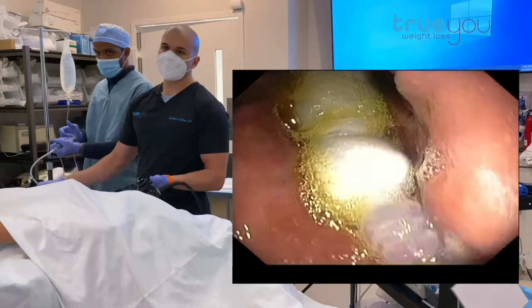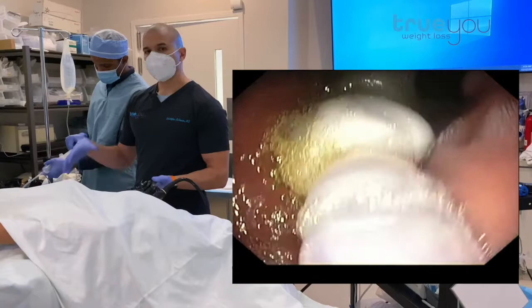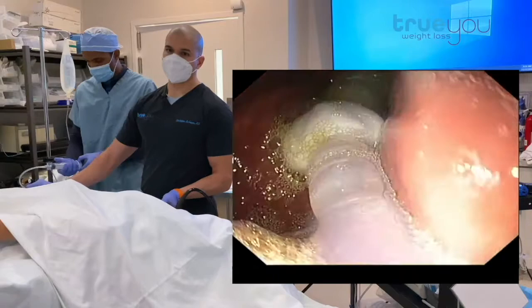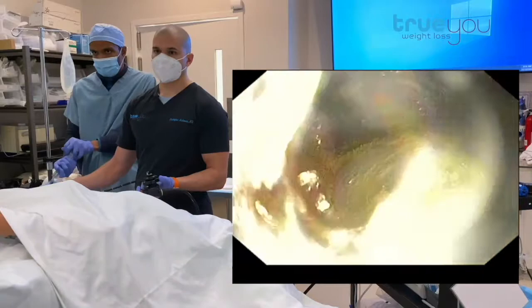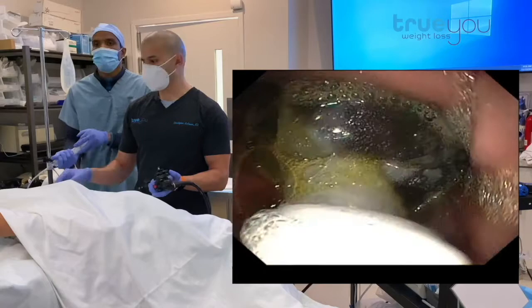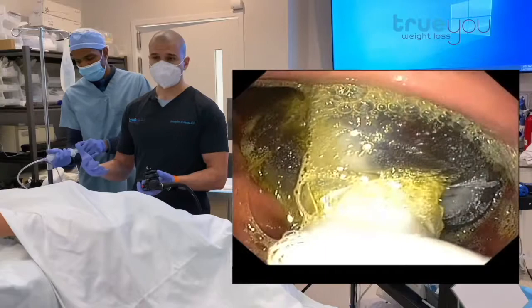What we want to do is fill it enough so that it keeps her nice and full and less hungry, but not too much. If we overfill it, she could have more symptoms like nausea and difficulty tolerating the balloon. Once we're finished filling it, we will detach this fill catheter and the balloon will seal, then it will just stay in the stomach for the next six months. The way the balloon works is two mechanisms: one is it's physically just taking up space, but the more important one is the balloon has some weight to it — about a pound and a half from all the fluid we're putting in. So it sinks to the bottom of the stomach and actually slows stomach emptying, meaning food and liquid take longer to exit, so when you eat you feel really full and that fullness lasts longer.